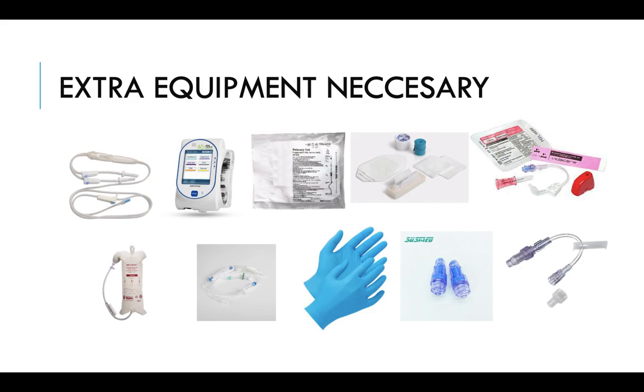I was told that these are meant for higher pressures to withstand the infuser bags and the pressure that they push through there, as well as the pressure that it takes to get it into the osseous space, versus the traditional J loops. So it is definitely preferred and recommended that you use the J loop in an IO kit for the IO only and don't pull one out of the IV kit.